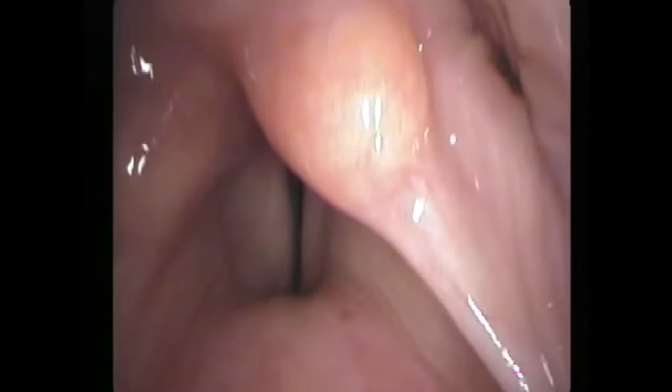All right then, I hope these example cases have been instructive and that you're able to focus your eyes on the vocal process and identify when the lateral cricoarytenoid muscle has been injured. I think it's the most missed injury in neurolaryngology. I'm Dr. James Thomas, the voice doctor. Feel free to comment on the video below - I'll try to address as many questions as I can.